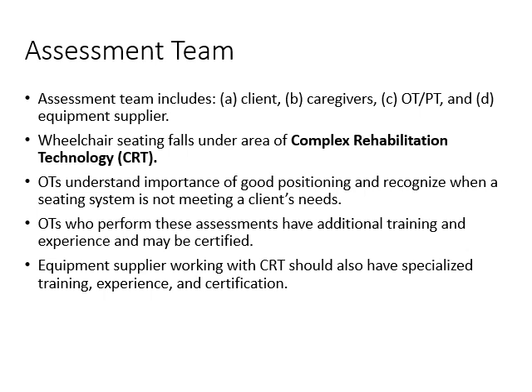I mentioned before that occupational therapists who perform these kinds of wheelchair assessments for complex rehabilitation technology do have additional training and specialization. They may require some additional certification in some areas. The equipment supplier also will have specialized training. Some equipment suppliers, vendors, are assistive technology professionals and have the acronym ATP behind their name.